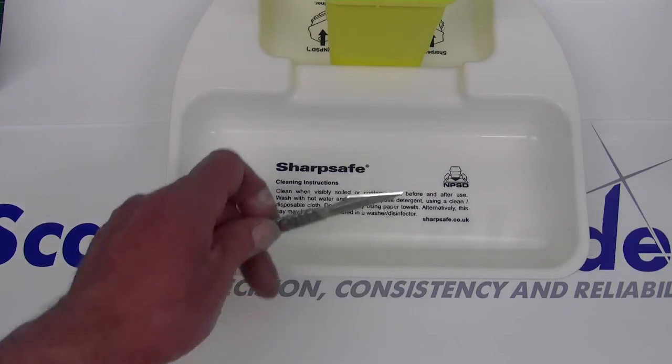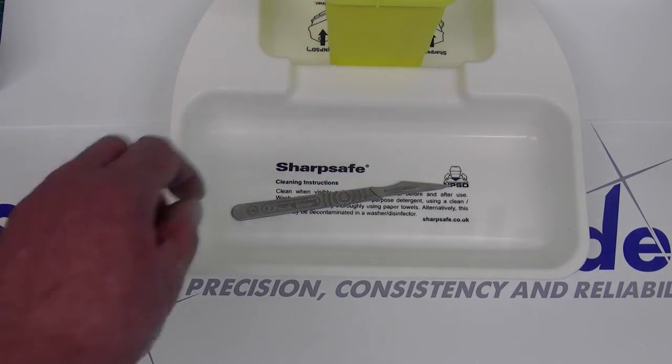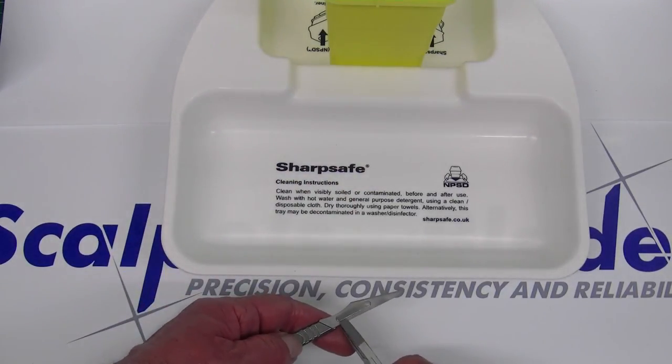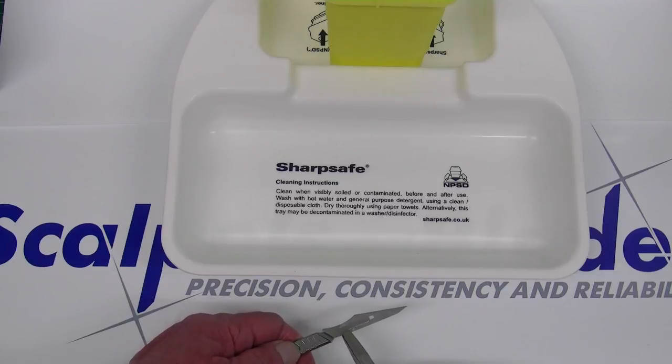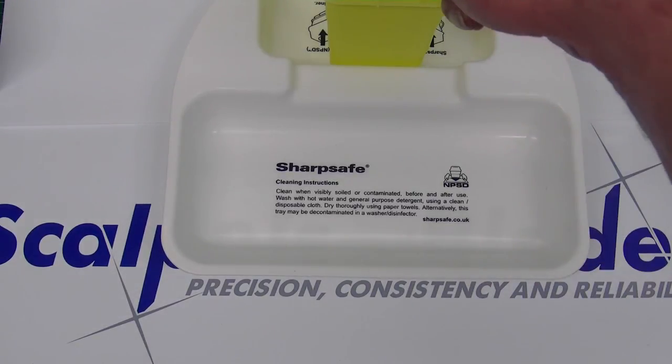When not in use, we suggest placing an assembled handle into a safety tray. To remove the blade, grip the blade at the back, lift slightly and move forward. Please always dispose of the blade into a sharps container.